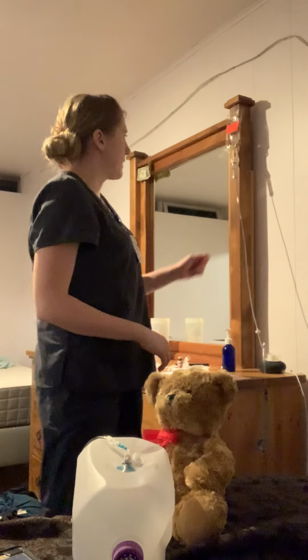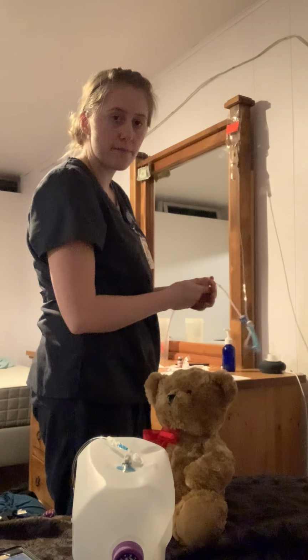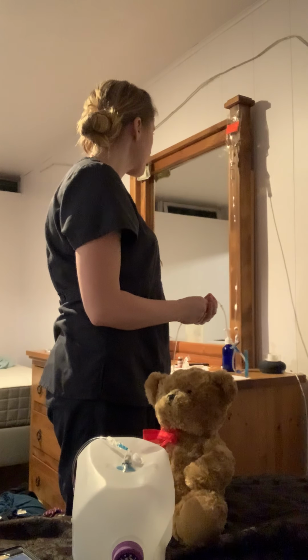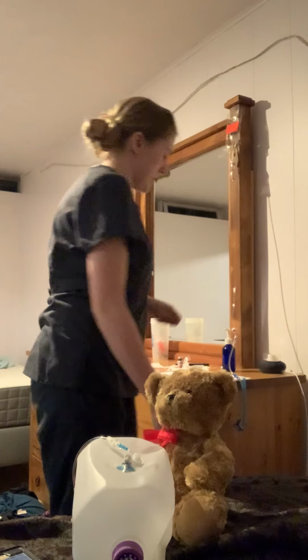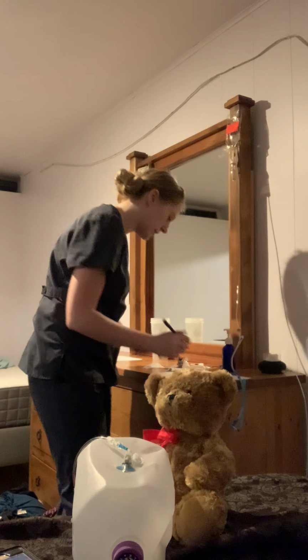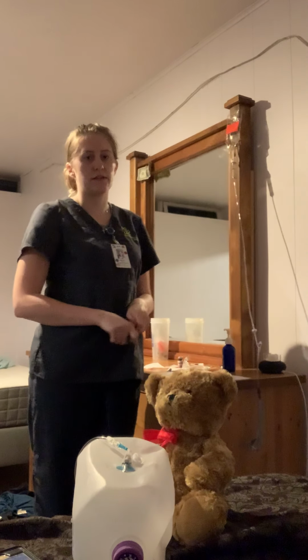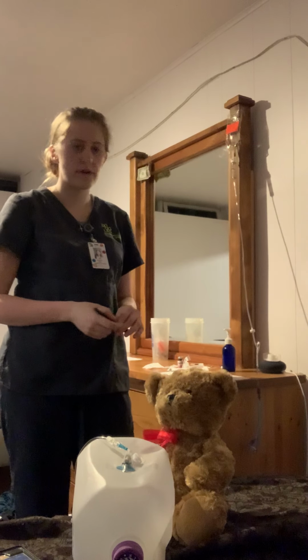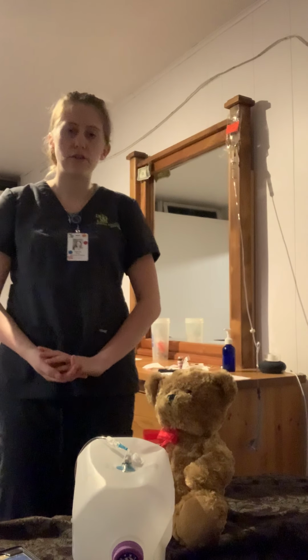Okay, and then I could restart the line again here. So I'll just unclamp it. Just looking for that drip. Okay, now I'd leave the room, sign off on the medication I gave. And then if I had any concerns, I'd notify the healthcare provider. Again, my patient has their call bell within reach, and they could notify me if anything, and then I'd go back in and check on them.